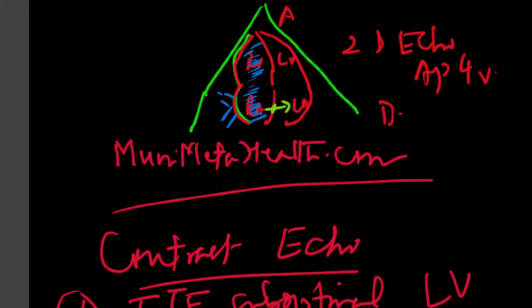Now, simultaneously, if it starts to show up here into the left atrium, now that clinches the diagnosis of right to left shunt. What have you diagnosed right away? In a matter of few seconds, as soon as you inject the agitated saline via the intravenous fluid, and all it takes is 7 to 10 cc's of abruptly pushed IV saline to go in, and those microbubbles that will form a specific contrast.